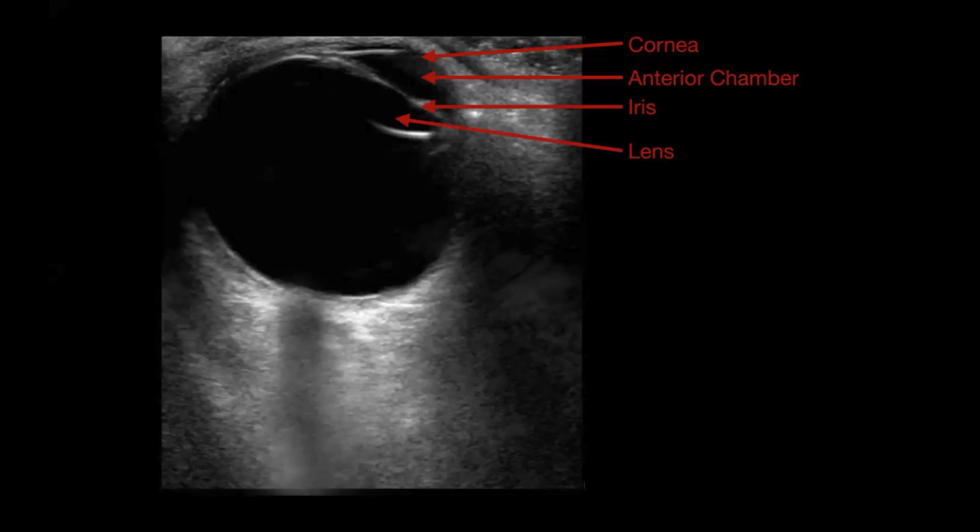I posted a case up on Twitter yesterday showing an example of an opacification in the lens, suggestive of a cataract. So there's the lens, and then deep to that, obviously, is going to be the vitreous body. Again, it should be pretty anechoic, right? You may see a little bit of floaters, really low level echoes in there as you scan through vitreous bodies, especially as we get older. But generally it's going to be anechoic. There shouldn't be a bunch of echogenic material in there.